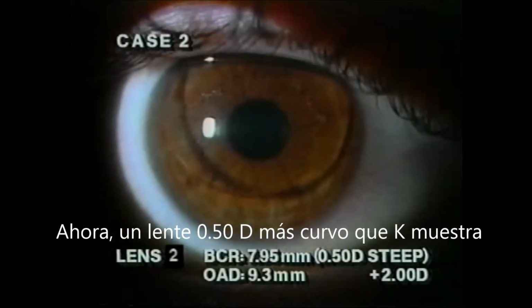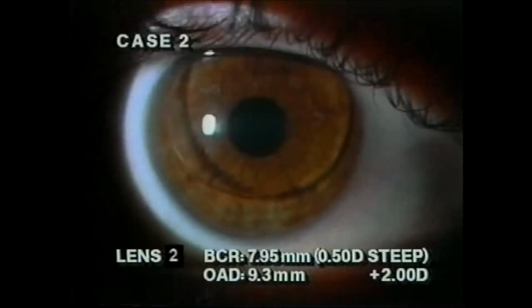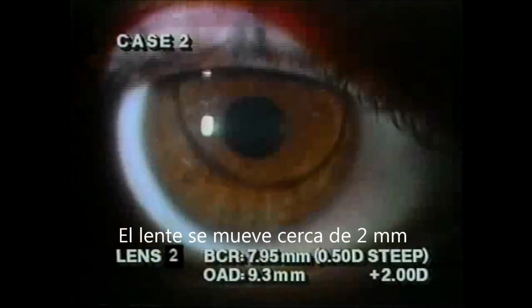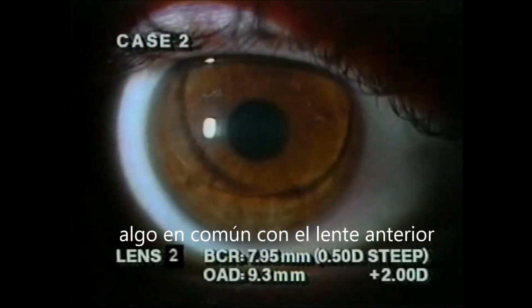Now, fitting a half diopter steeper than K, observe the good centration after the blink. Lens lag is about 2 millimeters. There is clearly an improved lens to cornea fitting relationship as compared to the previous flat lens.